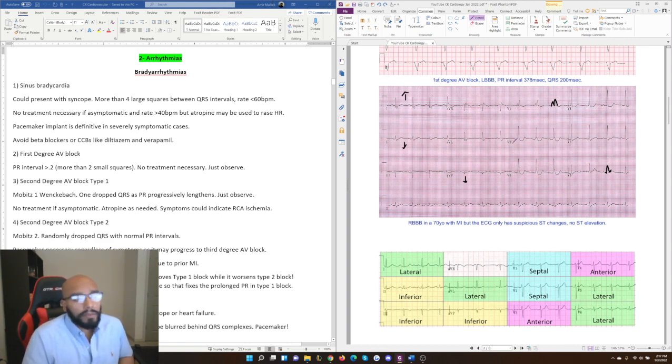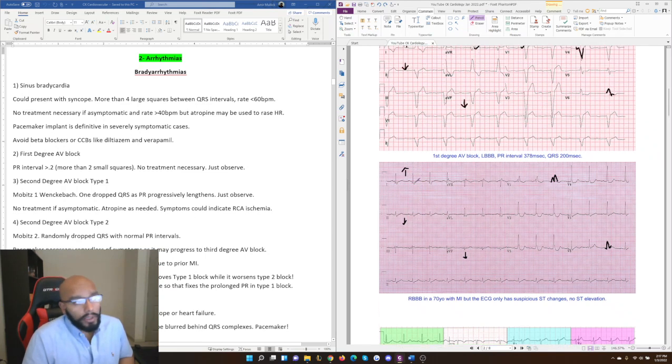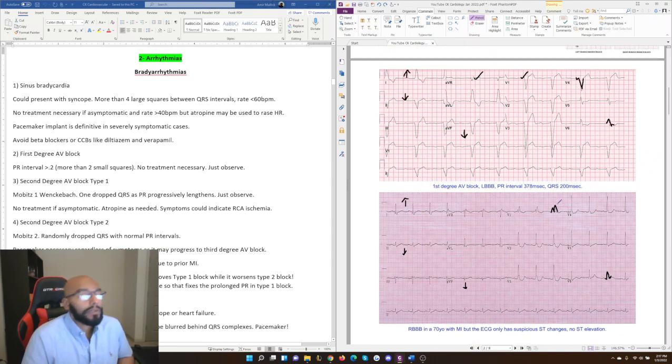Here we're just blocking electricity from moving in the correct direction. So you can see that it obviously has some alteration here, but it's not really an identifiable alteration. We can't say that right bundle branch block is always going to have left axis deviation. It can have right axis deviation also. So the relation is not one-to-one.